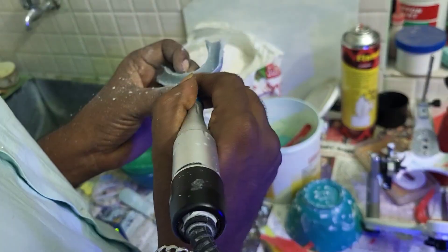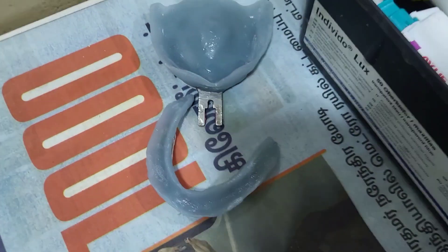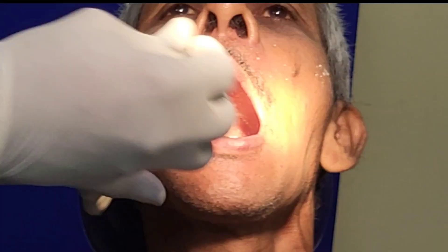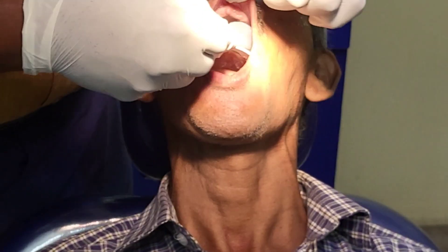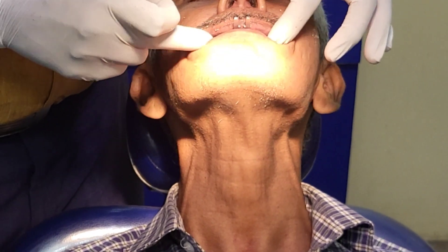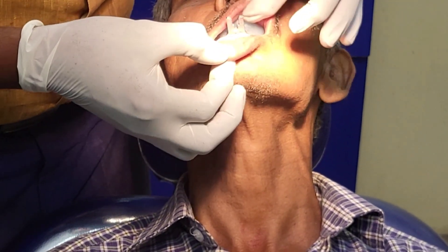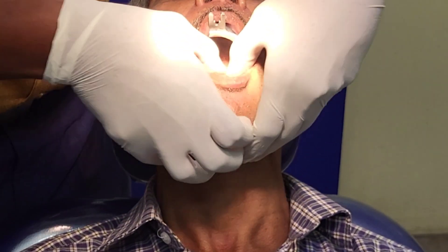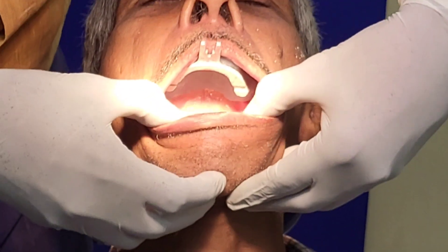After trimming, our special tray is ready and we are going to proceed with border molding. We have to check in the patient whether the tray sits exactly one millimeter below the borders. Do not trim excessively in the lab — we have to trim one millimeter below the borders by checking in the patient's mouth.